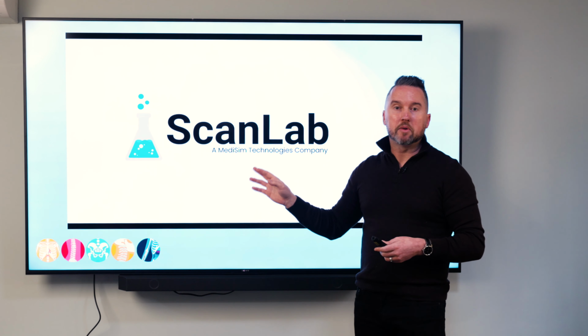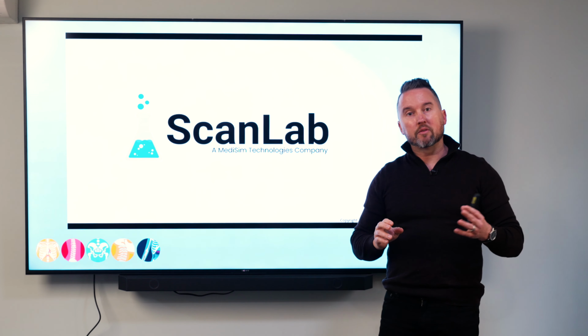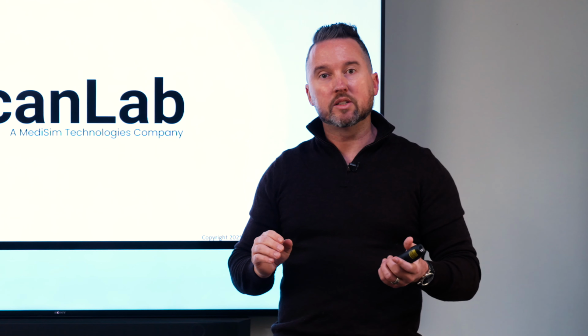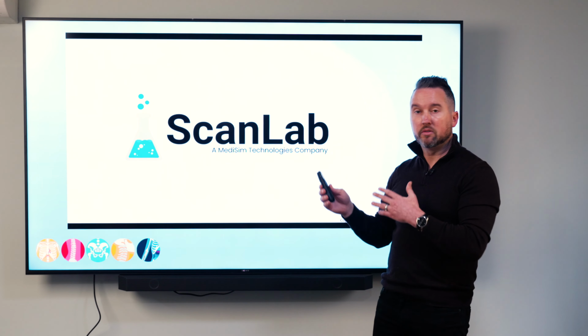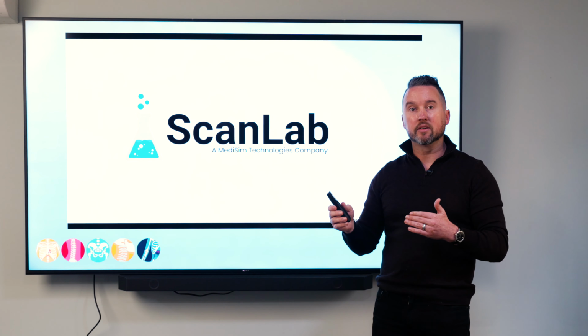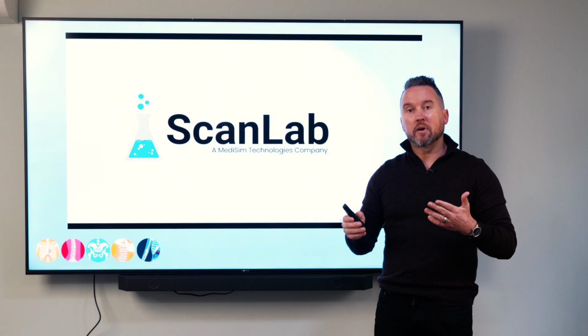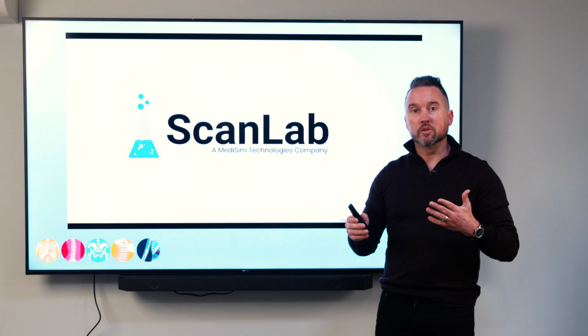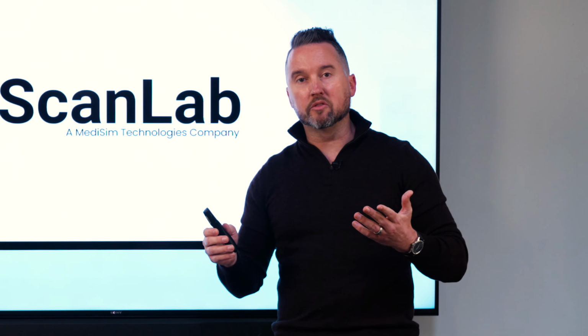We're incredibly excited about this. I think it takes us way further than we ever thought we would be able to go with the digital human. And who knows where we will go next, but I hope people enjoy this. I hope people get a lot out of it. And I think we'll be able to give them practice and responsible feedback when it comes to all the different variables that you would have normally in the clinical environment.